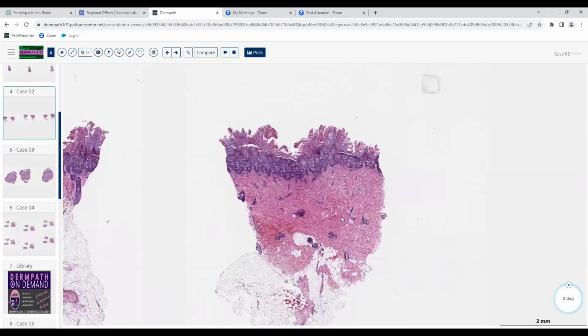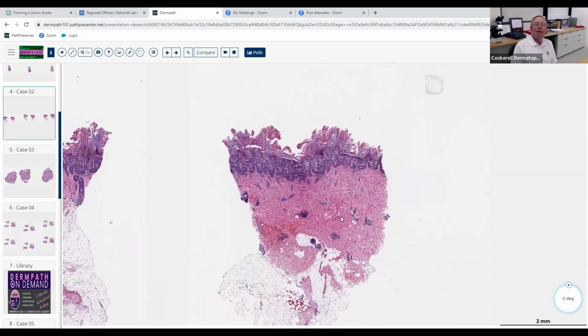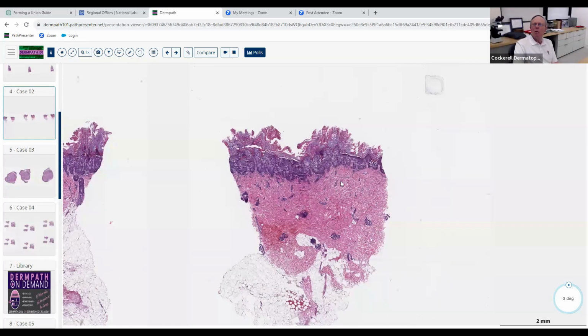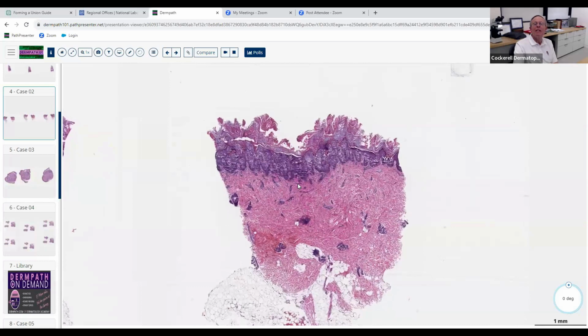So we're looking at this punch biopsy. Good. There's hyperkeratosis, looks like orthokeratosis, and some other epidermal changes going on, maybe like some acantholysis or spongiosis. Good, very good, excellent. Low power, that's great. Okay, what about any inflammation in the dermis? Yeah, so there's a superficial and deep perivascular infiltrate, it looks like. Yeah, and on a scale of 1 to 10, what are you going to give it? Tiny, like 2. Yeah, minimal. It may not really even be inflamed much at all. It's just a very sparse infiltrate, if much of anything.